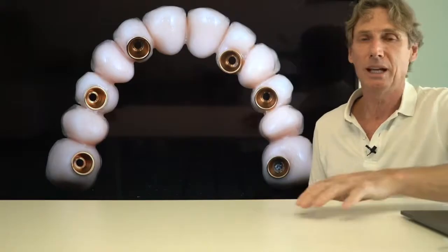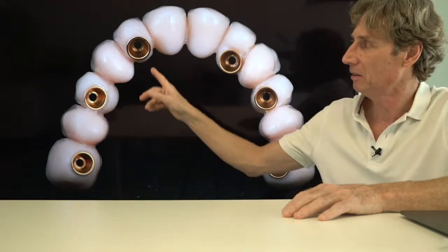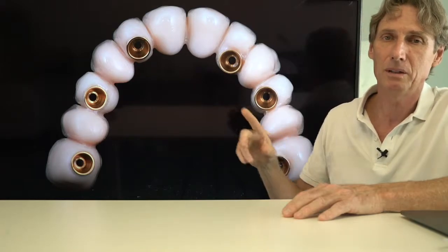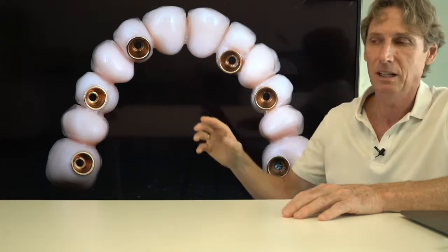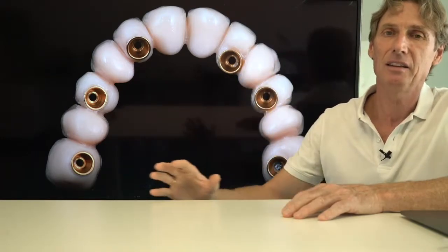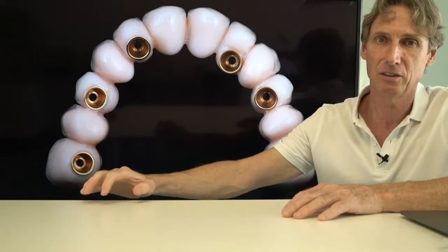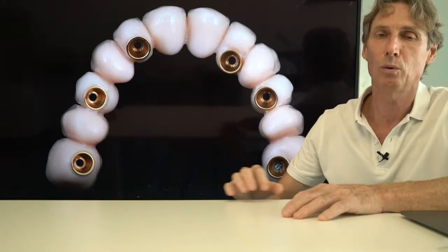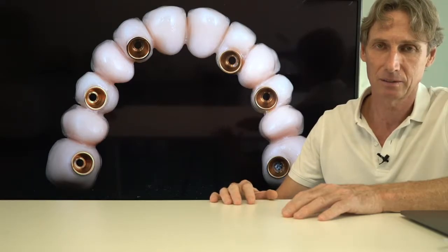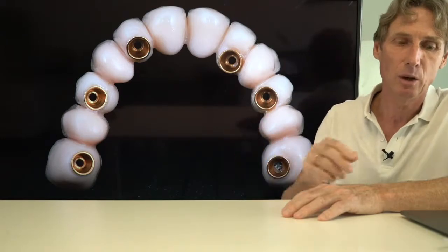Before, we had to glue these metal copings into the PMMA provisional bridges. But this is a big problem, because in the moment we have to glue in these copings, this provisional bridge has a different design than the definitive SIEWERT bridge made of the PEEK framework and the zirconia crowns. So we don't have the same workflow in the outcome process.